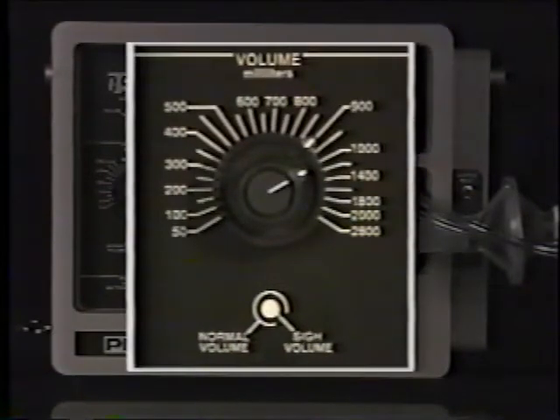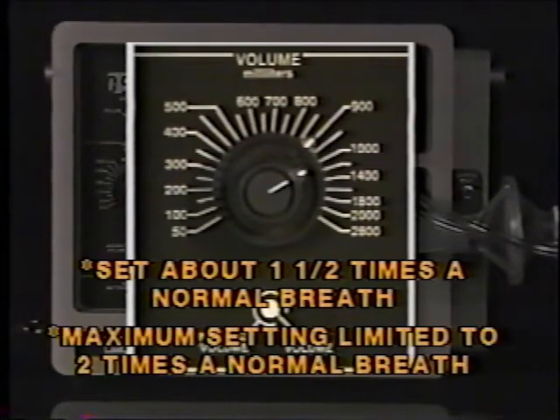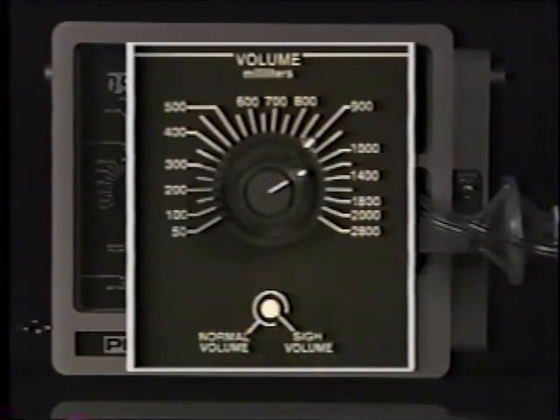The smaller knob on the volume control, labeled Sigh, determines the volume of air to be delivered when sigh breaths are prescribed. It is usually set about 1.5 times the amount of a normal breath. The sigh volume cannot be set lower than the normal volume setting. The maximum setting is limited to 2 times the normal volume setting, up to 2,800 milliliters.